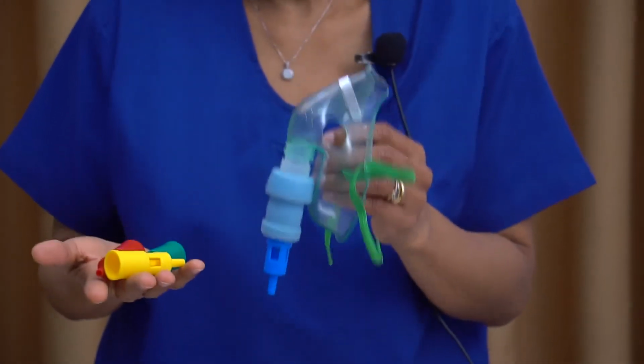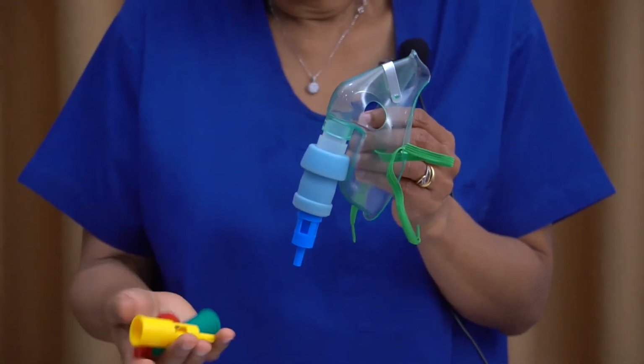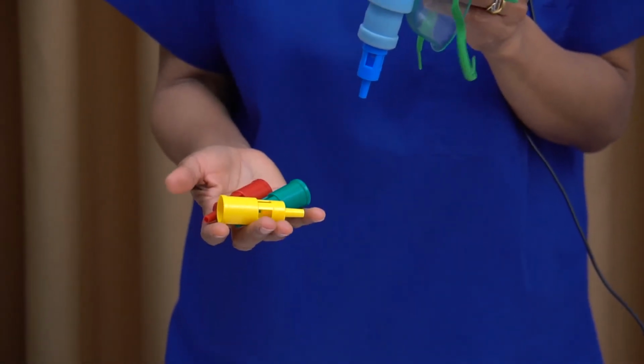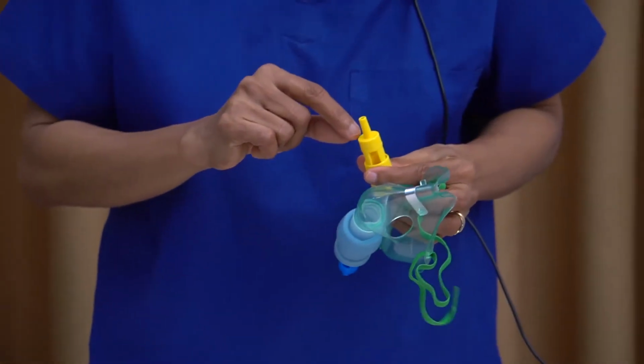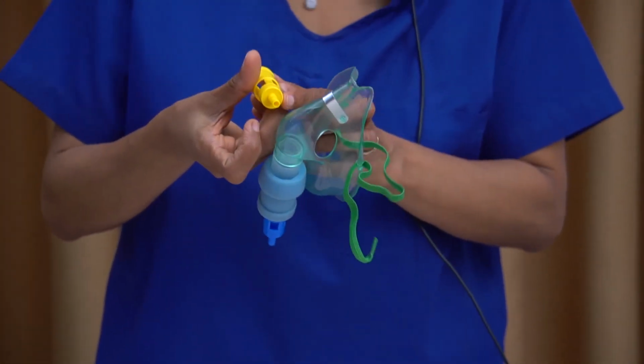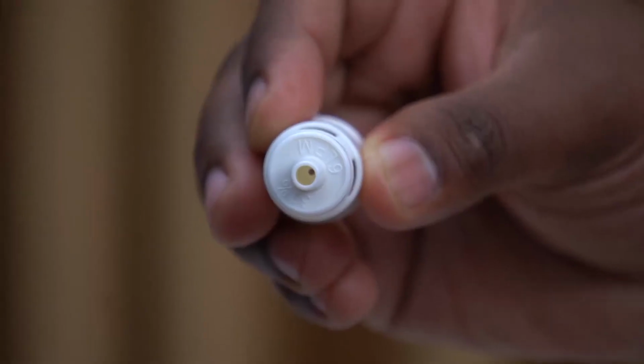This is a Venturi face mask. These are called Venturi devices. This color coding is not universal. In fact, if you look here, the flow rate and the delivered FiO2 are mentioned on the Venturi device.